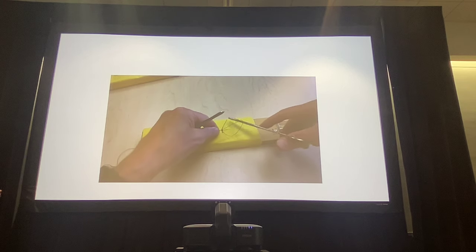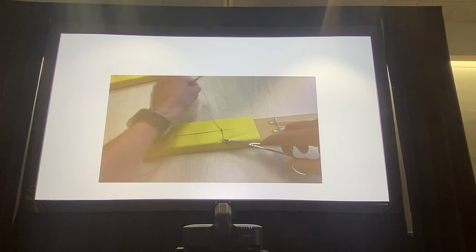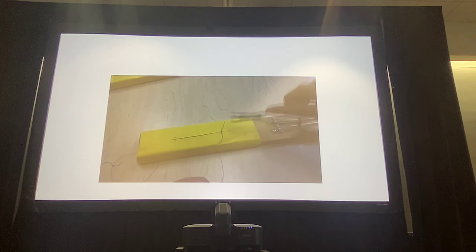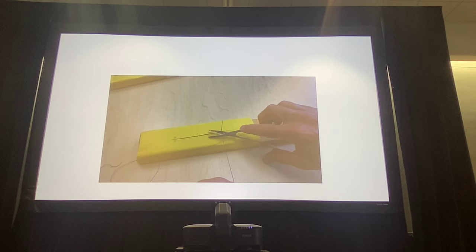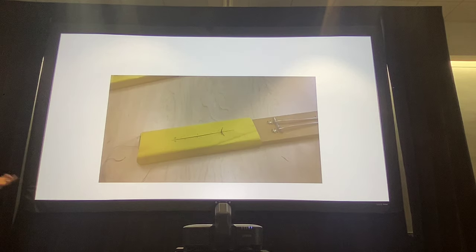So this we use. You can use for any viscera, so you can use it for small intestine, for enterotomy, you can use it for stomach, you can use it for bladder. Most of us, if we get more experienced, we do continuous on those organs. But as far as your concerns go, most often these are done for fascia and subcuticular, and especially the skin layer. So you'll just do multiple of these.